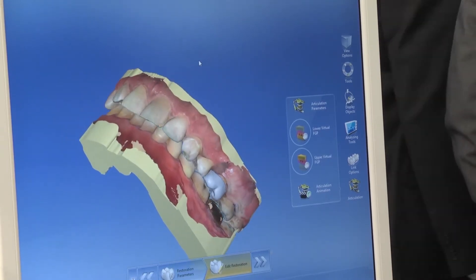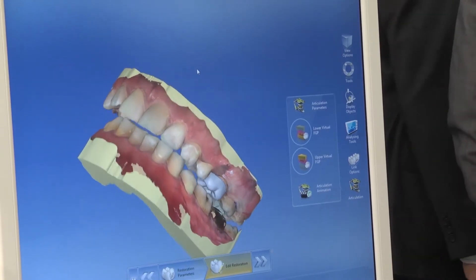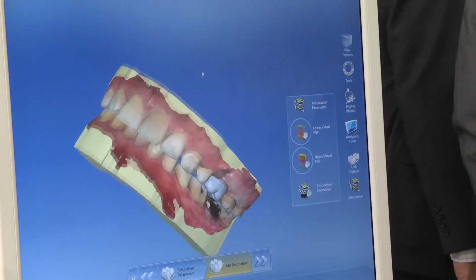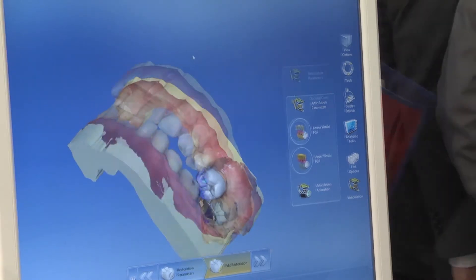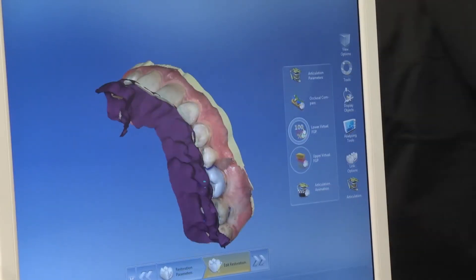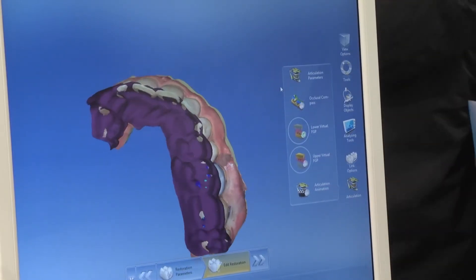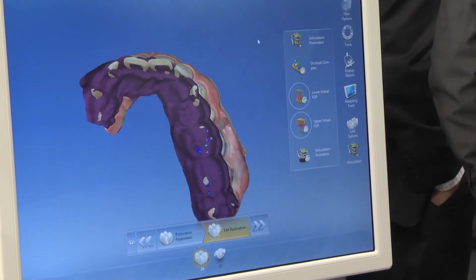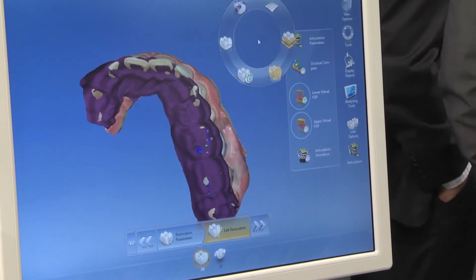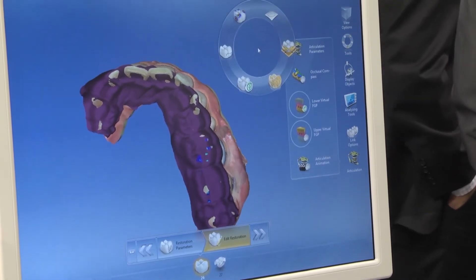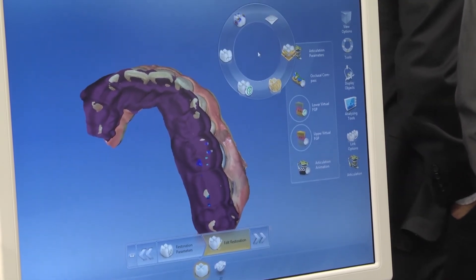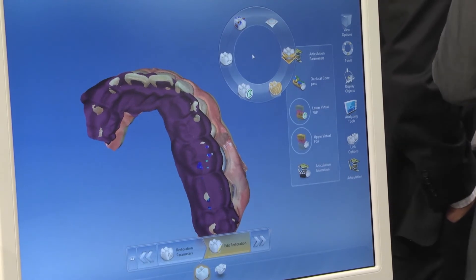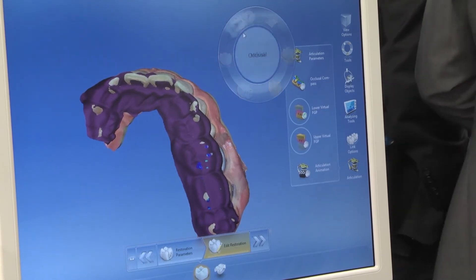The software displays the complete path of movement. The instruments allow individual intervention to remove early contacts in the occlusion with just one click.